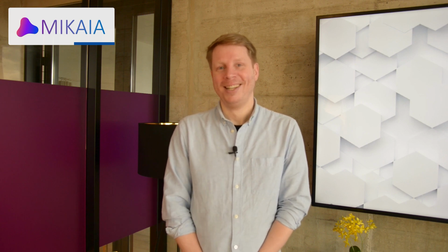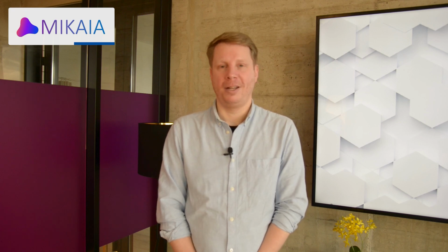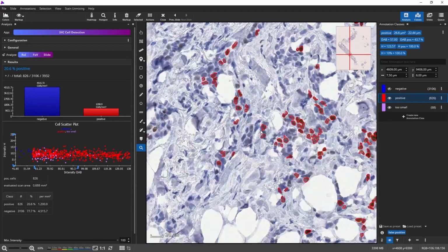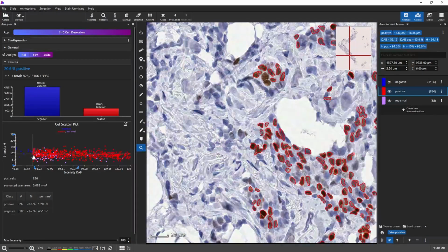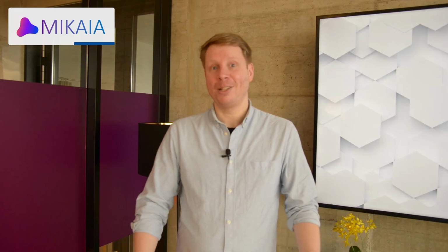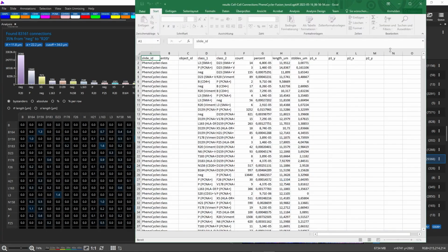I think it's just, it's 2023, so digital image analysis has a couple of advantages over analog manual eyeballing. It takes a lot of time and it's really tedious work to count cells in a slide or in multiple slides even. And if you work digitally, you can just analyze an entire data set of hundreds of slides automatically.